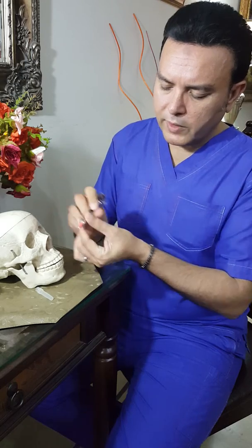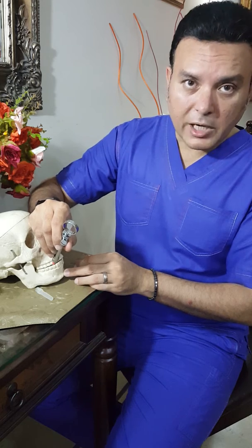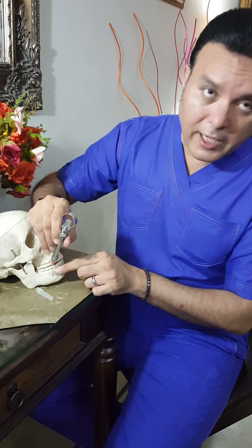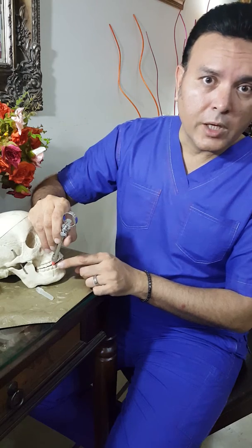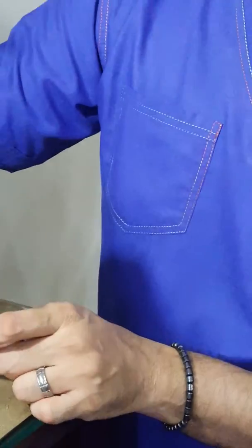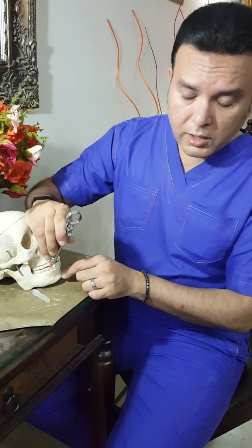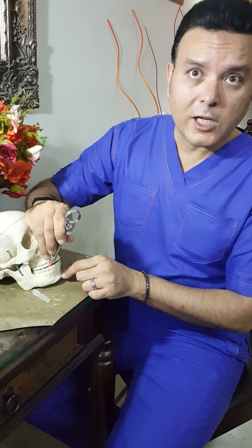A medium-length needle would be fine. You go in on the facial right between the first and second primary molar and go deep in — about 75% of the length of the needle from the CEJ, or almost full length from the occlusal. On a primary molar you don't even need to go the full length, but if you do, you'll be able to reach all the way to the mental foramen. On adults the mental foramen is smaller due to ossification, but on a child in the primary dentition this mental foramen is even larger.